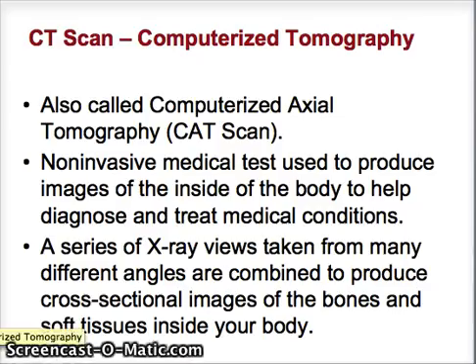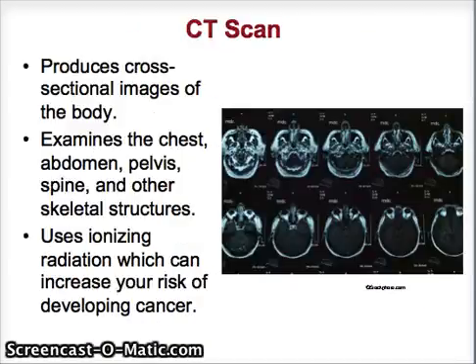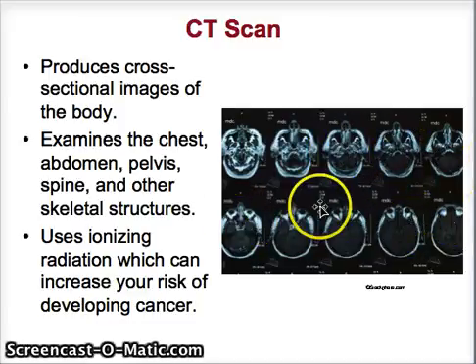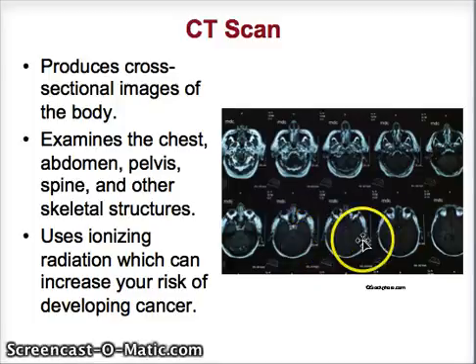Alright, CT scan. So generally these are used depending on what you're looking at, and also if you have a more serious injury. Again, this is not invasive. It's pretty much a bunch of different x-rays taken from many different angles, and then it produces a cross-sectional image of the bones or soft tissues in your body. So here's your skull, and it's been taken at various different sections, slightly different areas. You see how the eyes are positioned differently, so you can see inside and look at the different tissues.